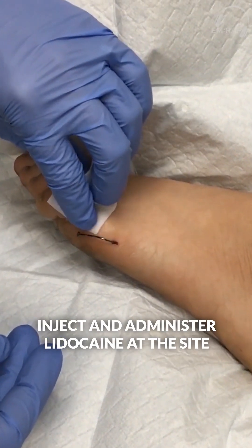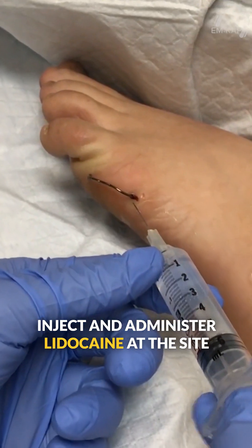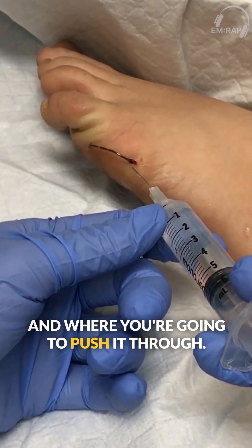Cleanse the skin where you're going to inject, and administer lidocaine at the site and where you're going to push it through.